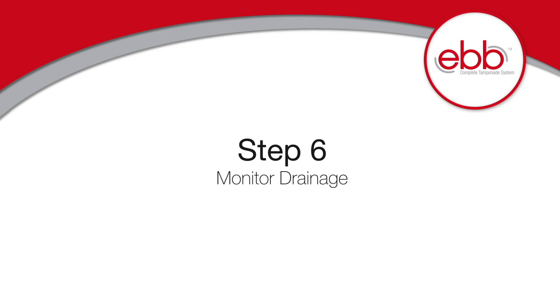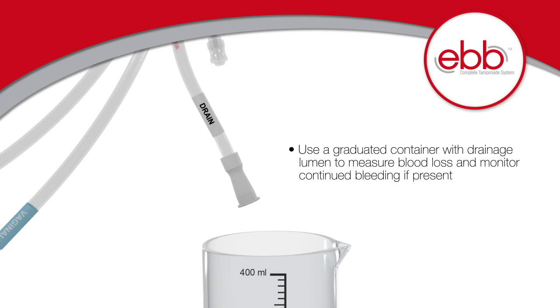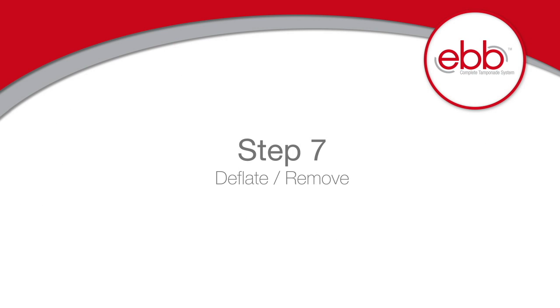Step 6: Monitor drainage. Attach a Foley or graduated container to the drain port to measure blood loss and monitor continued bleeding. If needed, check drainage lumen patency by irrigating with a small amount of isotonic solution through the irrigation port.